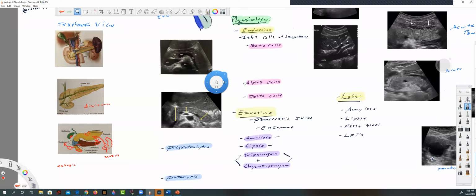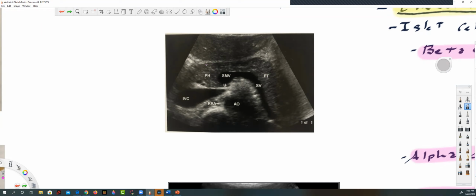We always say CBD here, but it is what it is. I don't see this person's GDA, and that's okay. It doesn't really matter. GDA could be there, it could be there, it could be all around. But in any case, if we find a little circle up here, there's our GDA.